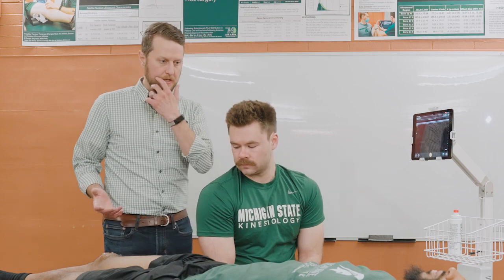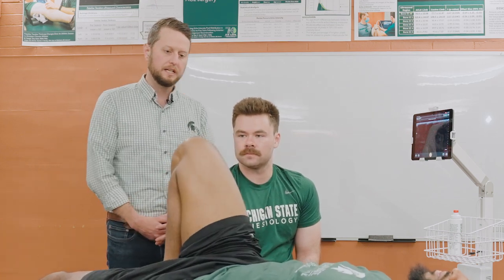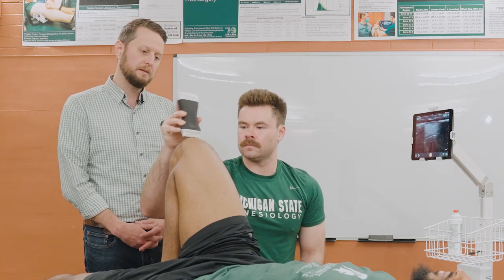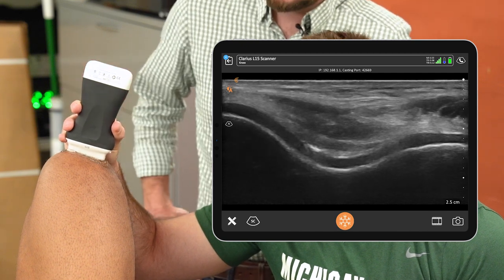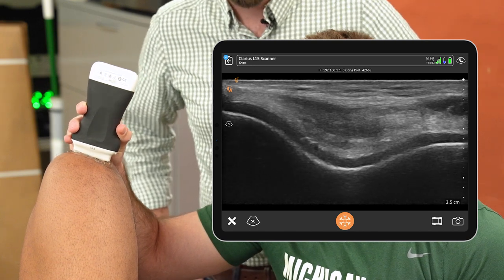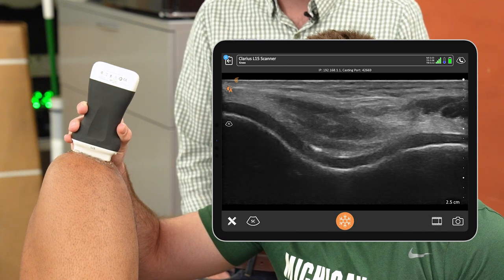What we're going to be doing today is we'll have our participant positioned supine on their back and we'll have them flex their knee to maximum knee flexion and get them to hold it into that position. Once we have them into that position, we'll place the ultrasound probe up here on top of the knee in this suprapatellar position in a cross-sectional view where we can get this view of our articular cartilage.